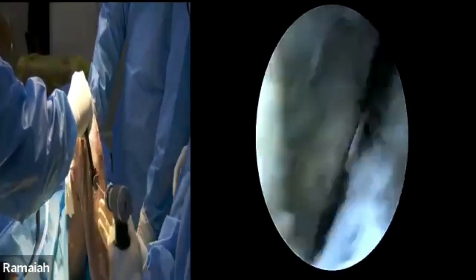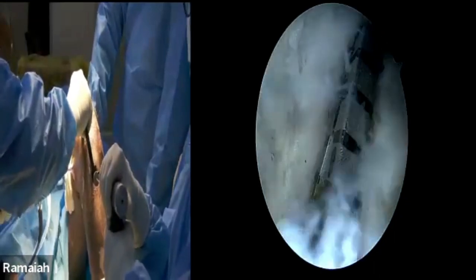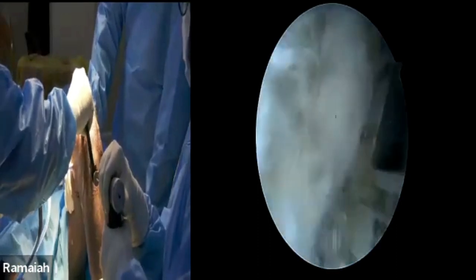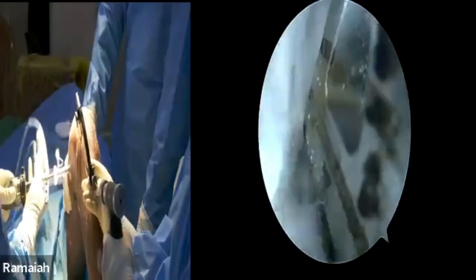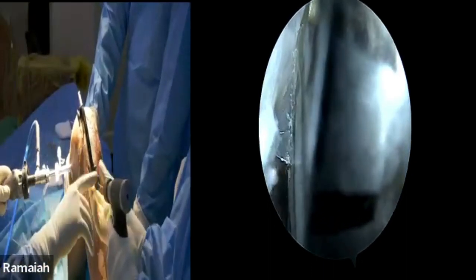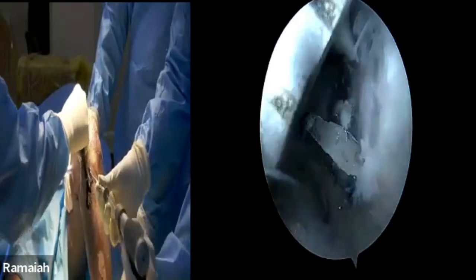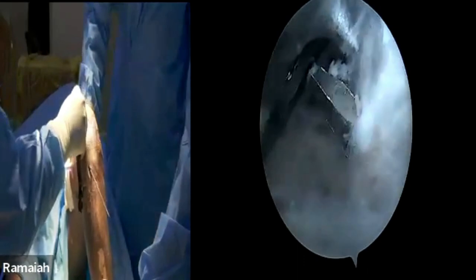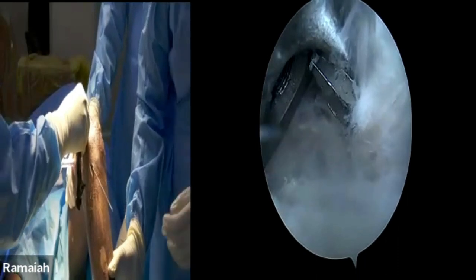This jig has a nice pointer — you can appreciate where the wire will stop, so by feel you can guide it. The jig is confirmed in position. It's 8 mm — you can drill. The jig can also act like a protection sleeve so you don't inadvertently enter the posterior capsule by mistake. I hope things are clear up to this point.